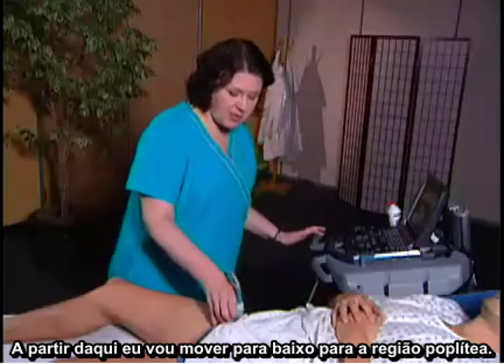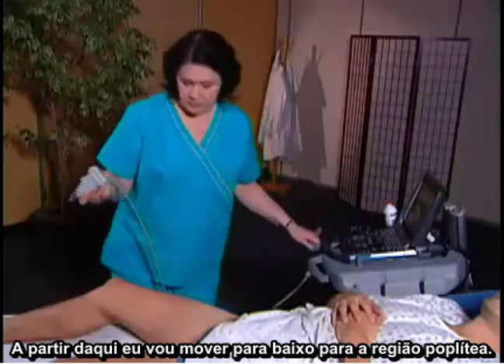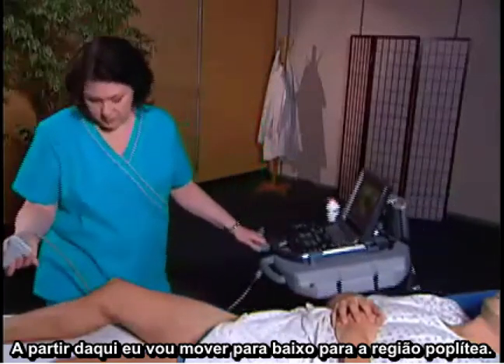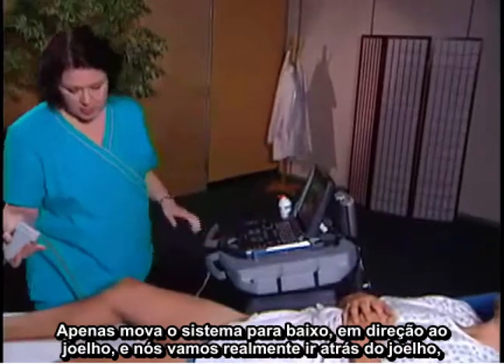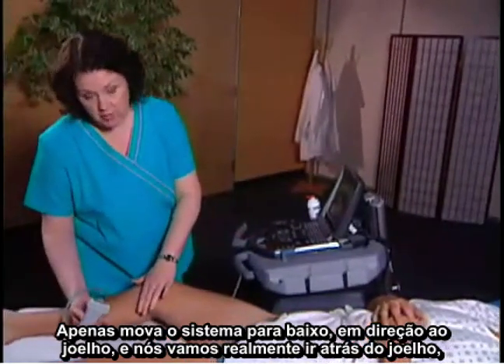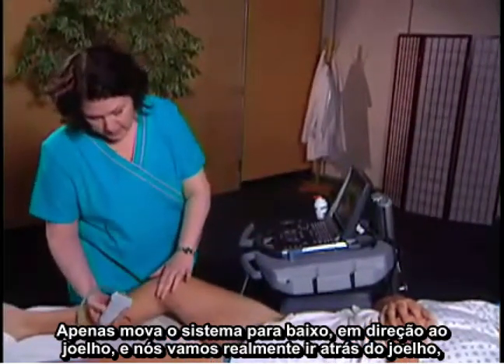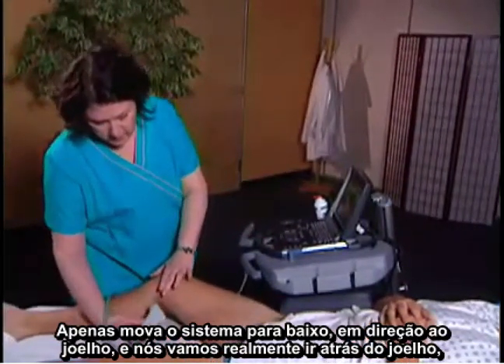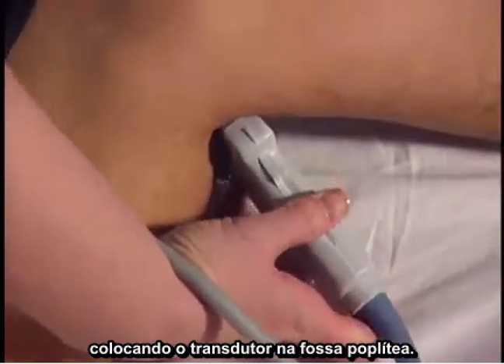From here, I'm going to move down to the popliteal region. Just move the system down towards the knee, and we're actually going to go behind the knee, putting the transducer into the popliteal fossa.